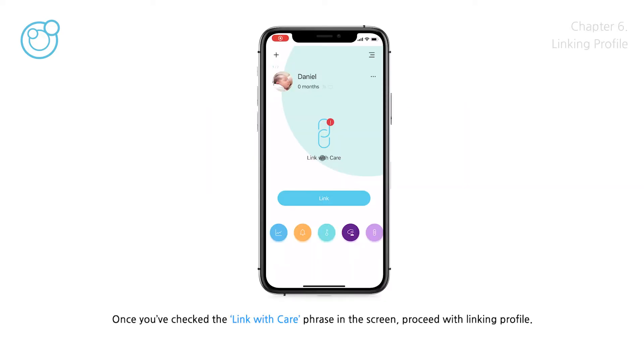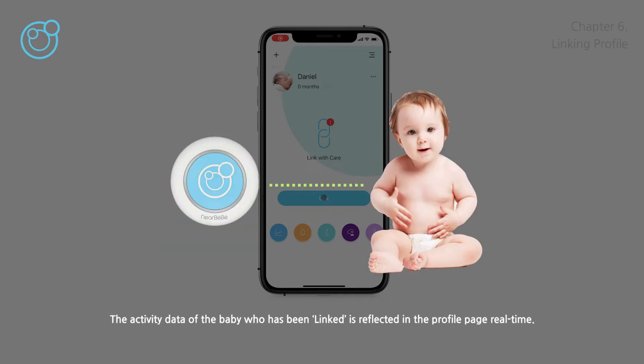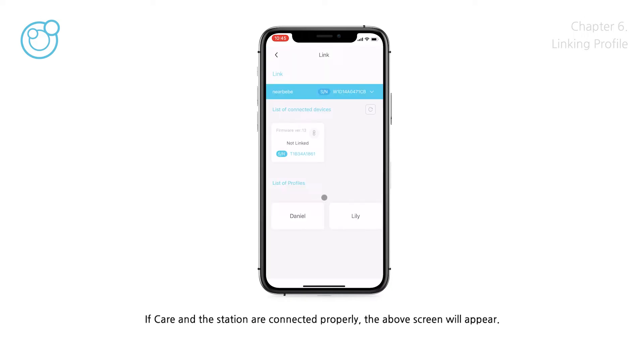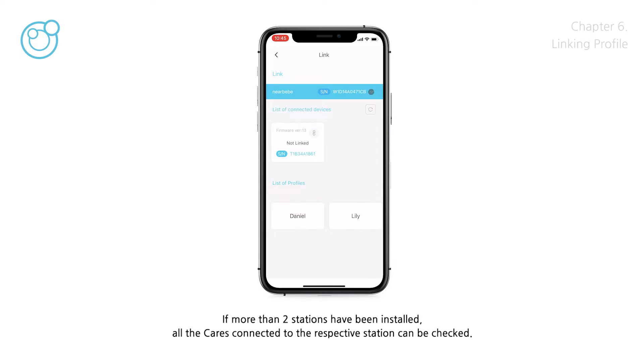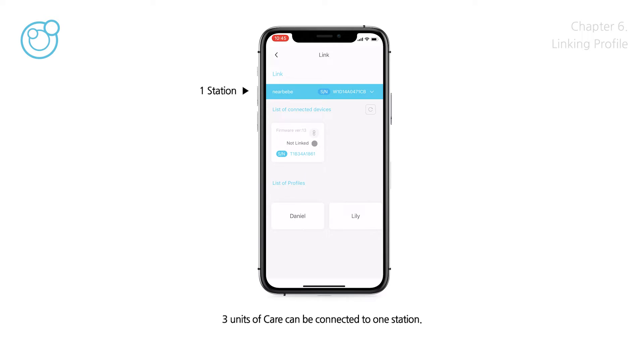Once you've confirmed the 'Check the link with care' phrase on the screen, proceed with linking the profile. Link refers to linking care with the baby to be monitored — one care per profile can be linked. The activity data of the linked baby is reflected in the profile page in real time. Tap the link button at the bottom of the screen, or tap the link icon among the round buttons to see the link page. If care and the station are connected properly, the link screen will appear, showing information on the installed station.